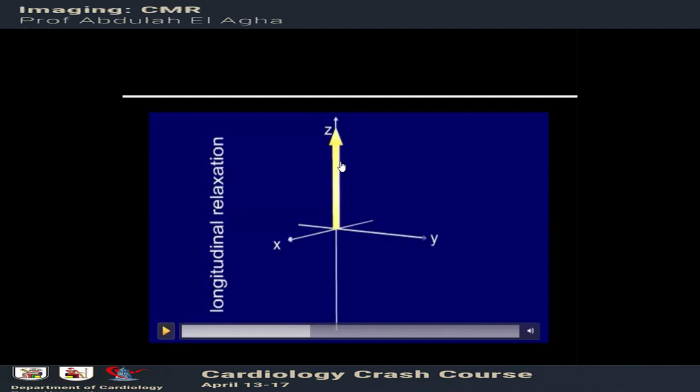دلوقتي بيحصل لوس أوف كوهيرنس، بيبعدوا عن بعض. سموا الوقت ده اللي هم البروتونز تبعد عن بعض سموه التايم الثاني أو T2. طيب إيه فايدة اللي انت بتقوله T1 وT2؟ لقوا إن ربنا خلق كل تيشو موجود في جسمنا في T1 وT2 مختلفه عن الثاني.